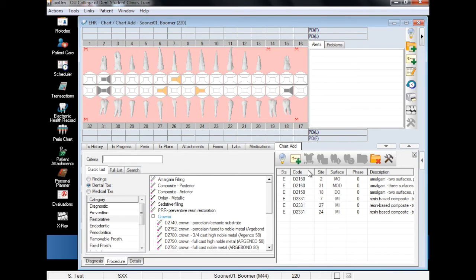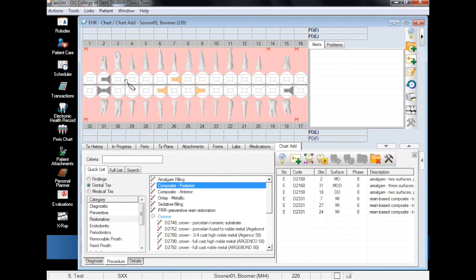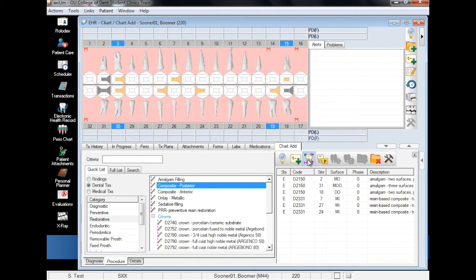The same process applies to posterior composite fillings. Select the surfaces, add finding, and you're finished.